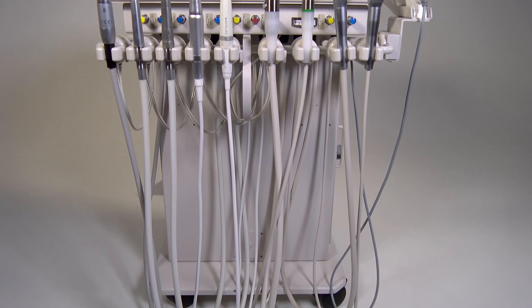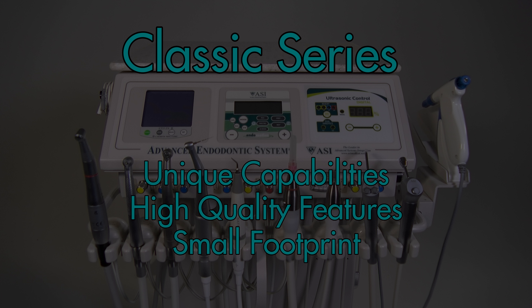ASI's Classic Series of our advanced system line features unique capabilities and high-quality features with a small footprint to fit well in most operatory designs.